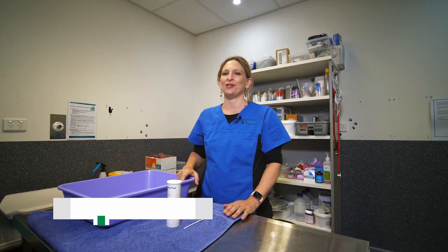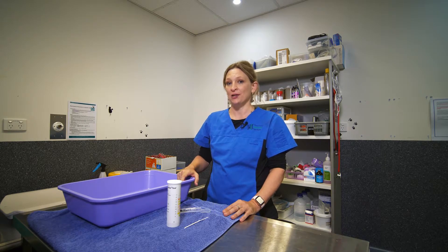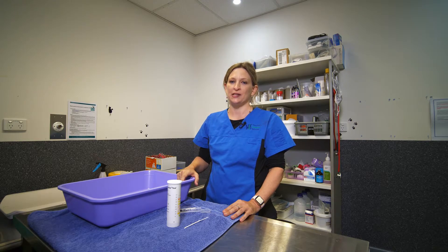Good morning everyone. My name is Dr Rachel Cormann. I'm the feline specialist at Veterinary Specialist Services and this short video is just to demonstrate how to perform a urine dipstick on a urine sample from your cat at home.